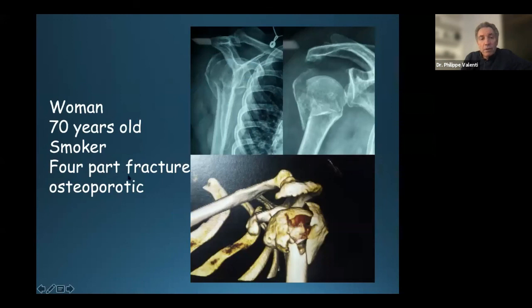This is an example here of a woman with a fracture dislocation, a smoker, 4-part fracture. We systematically use a CT scan preoperatively. We don't do this surgery during the night, but as an elective procedure.